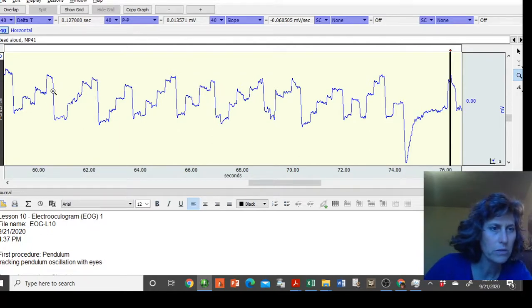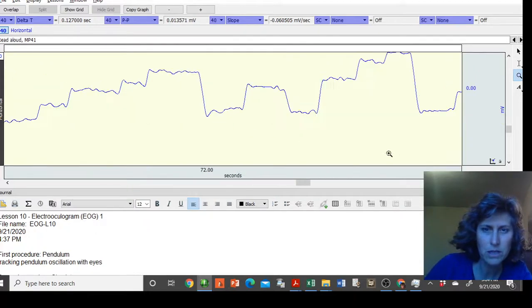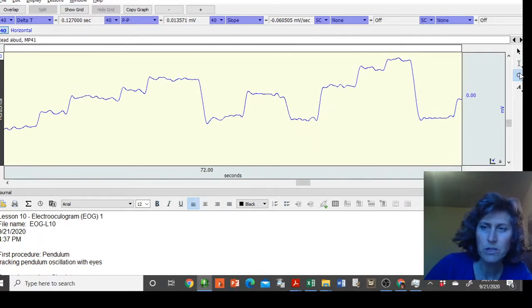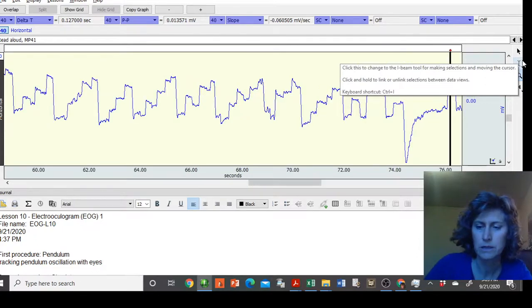It's kind of arbitrary whether you choose 2 or 3 or something else. You might choose something that's kind of like this one is a little easier to measure, but then the next one is a mess. So you might try to measure ones that are easier for you to measure, but make sure you keep track. Whichever line you do, I'm going to Control minus here.